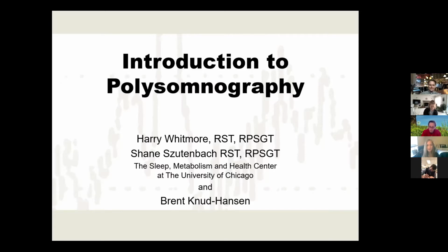So to start off, does anybody know what polysomnography means? Okay, so basically it's a multi-parametric test that is used in the study of sleep. If you break down the word polysomnography into its Greek roots, you have poly, which means many, somno, which stands for sleep, and graphy, which means to write.